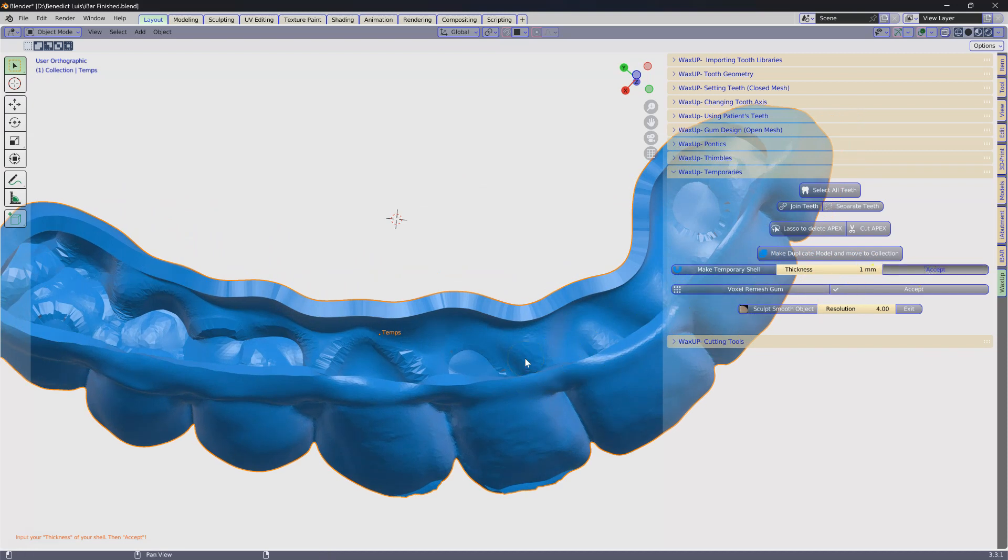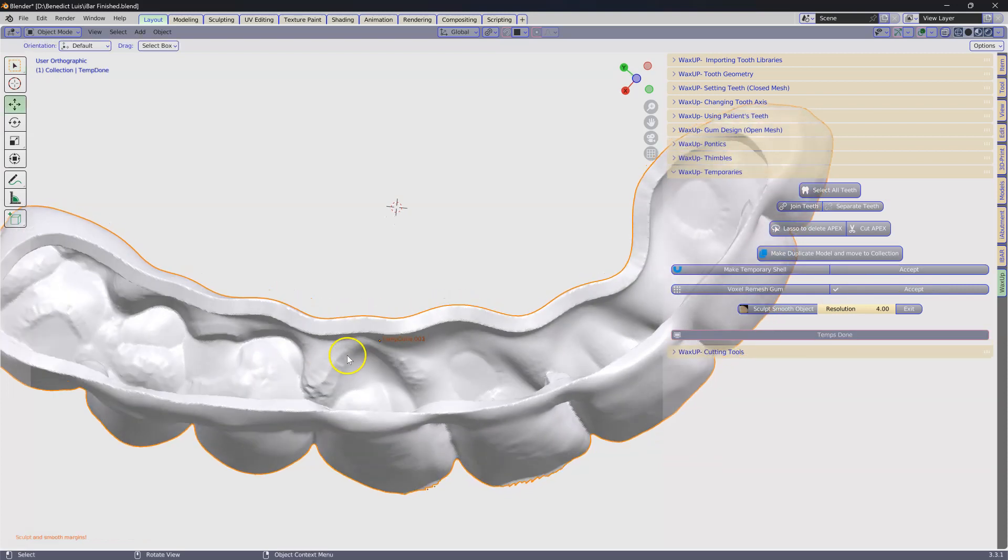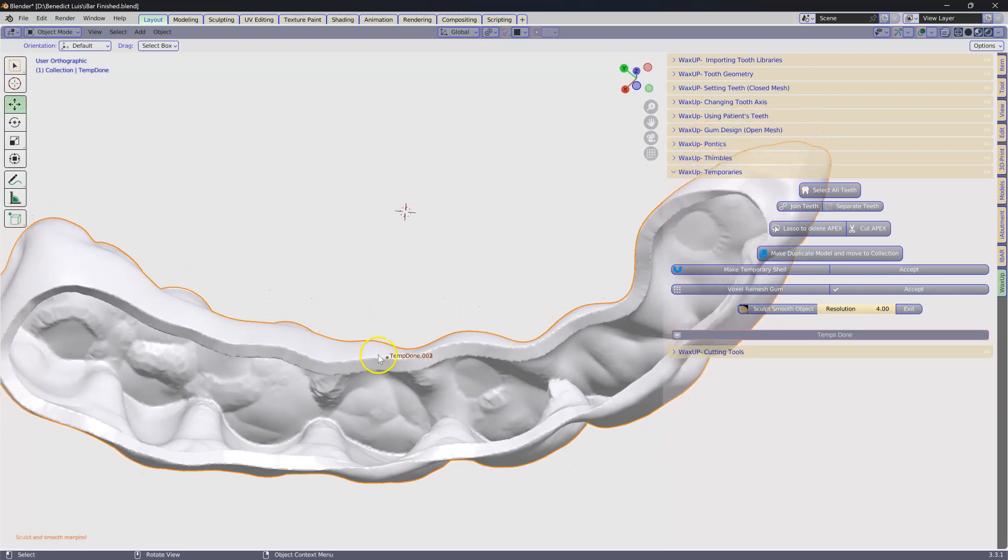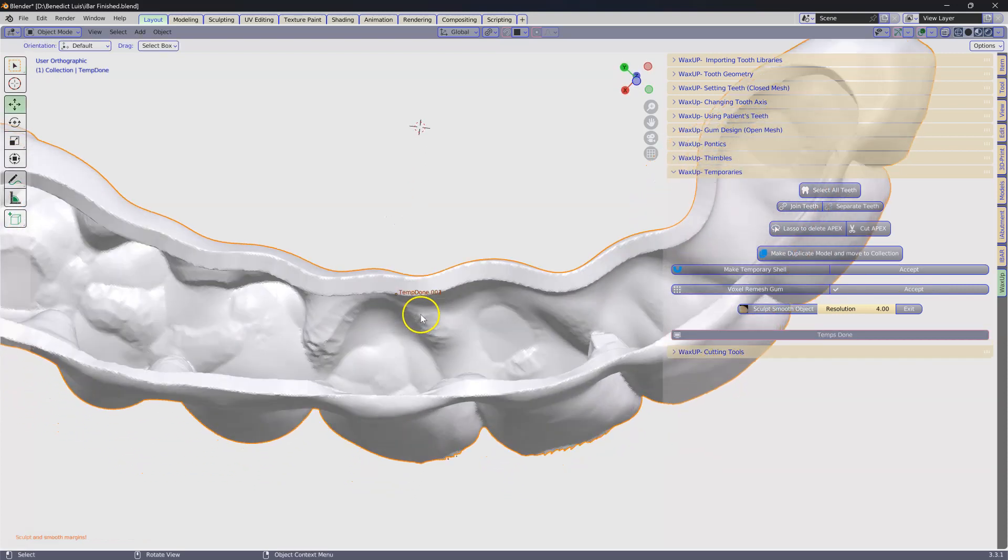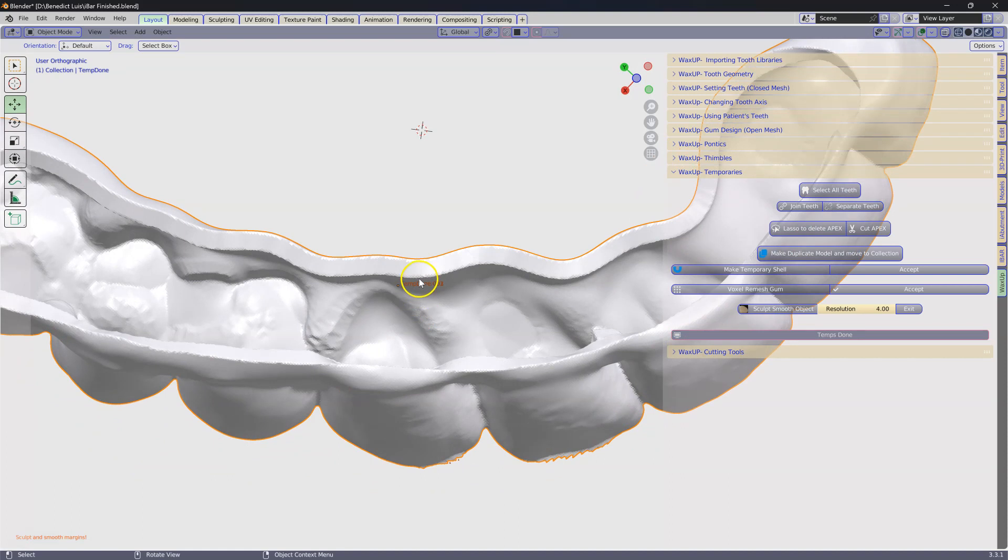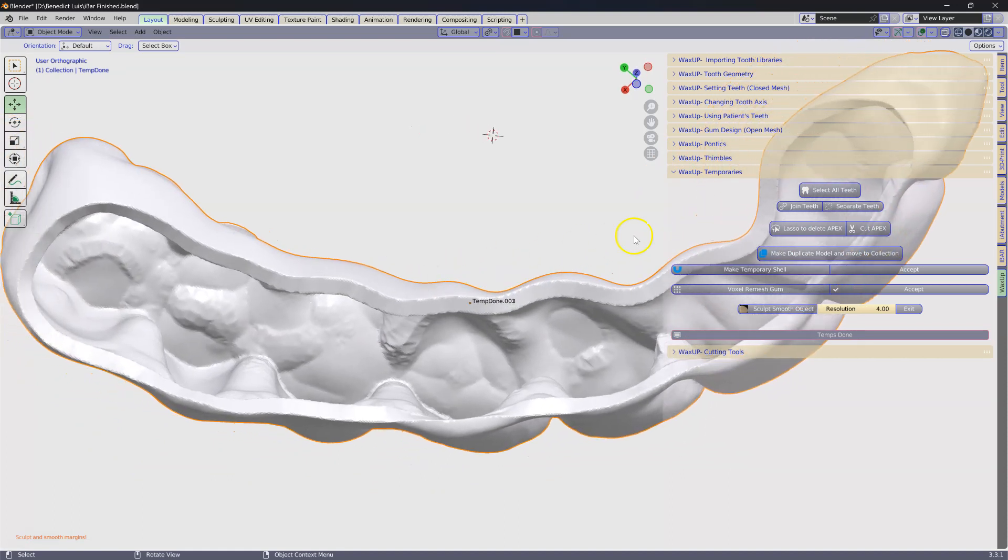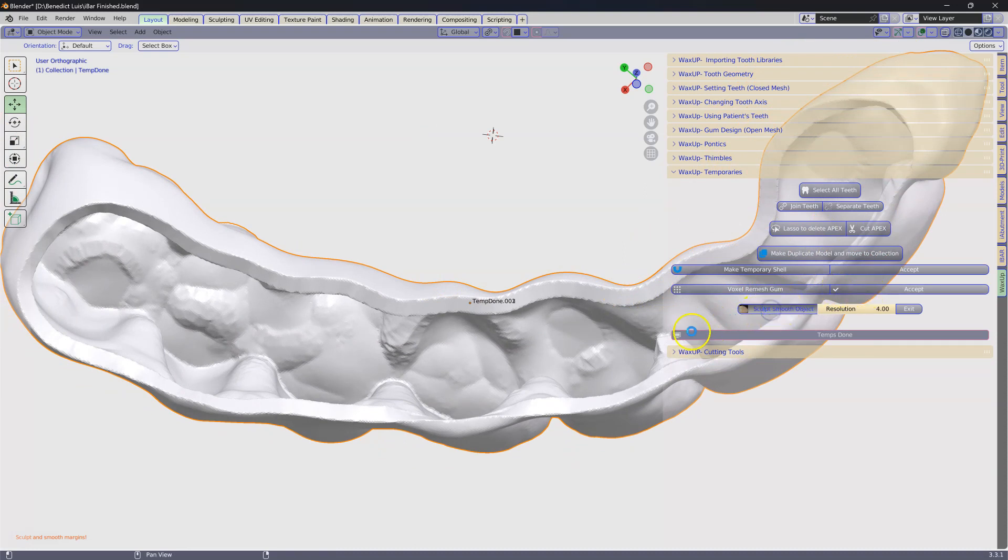Now what that does is it's going to voxel remesh this inadequate mesh to make it print worthy. Then we don't have to voxel remesh again. You're going to click on smooth.